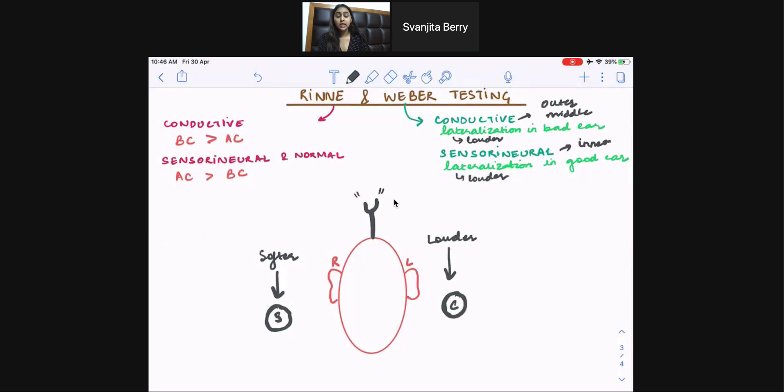Now, how do we do the Rinne test? We take a tuning fork, and we start by placing it on the mastoid process of our patient. And we ask the patient to let us know when they stop hearing the tuning fork. Now, this time represents the bone conduction time.